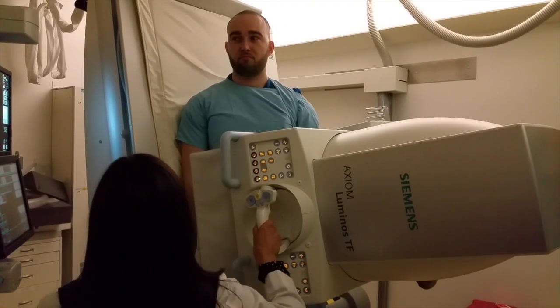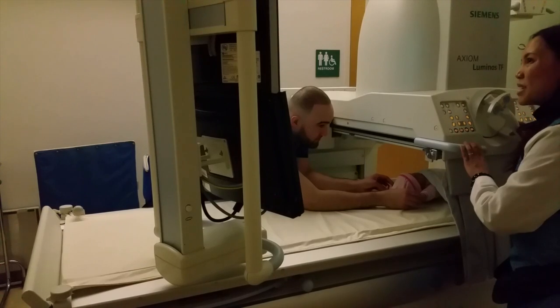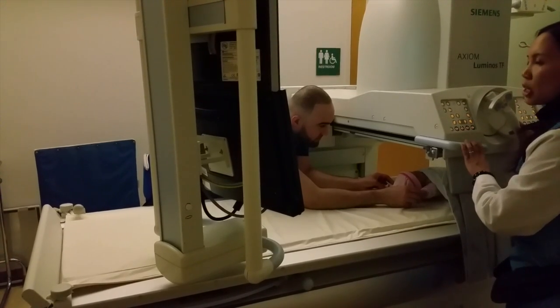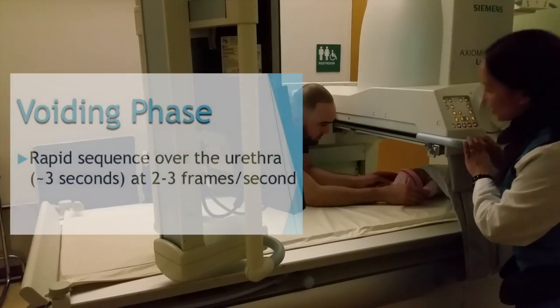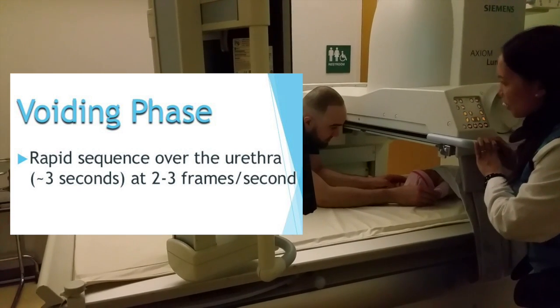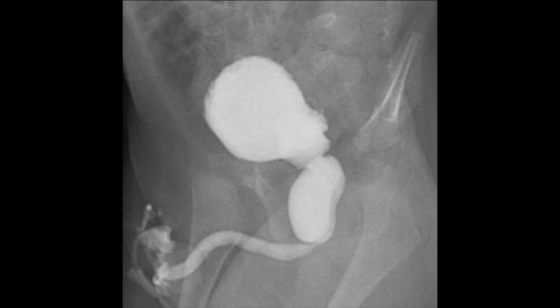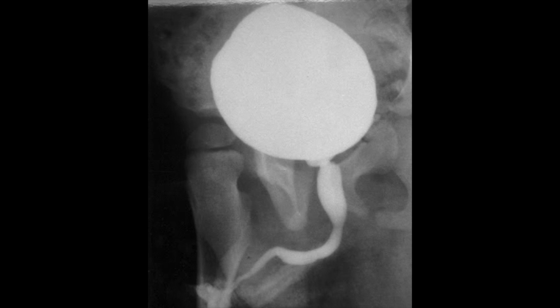If the patient is an infant or baby, they are closely monitored visually and fluoroscopically during both the filling and voiding phases. The entire urethra should be demonstrated during the voiding phase. To image the urethra, boys should be positioned obliquely during voiding, with slight offset of the hips such that they are not superimposed.